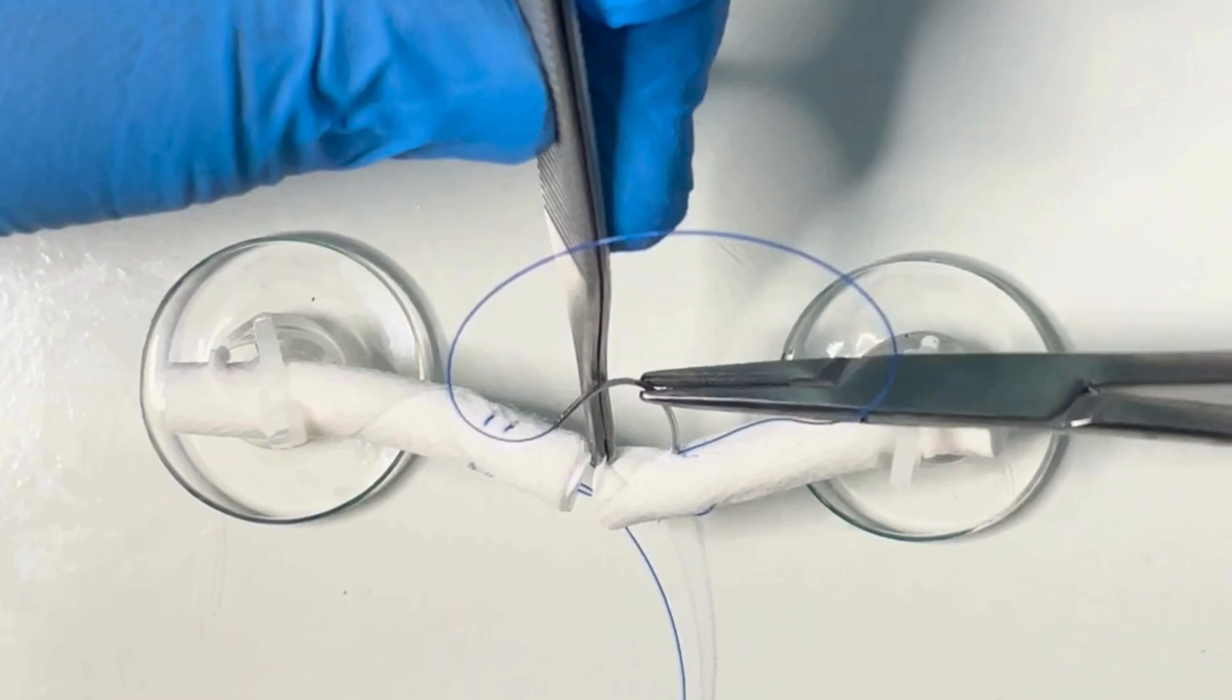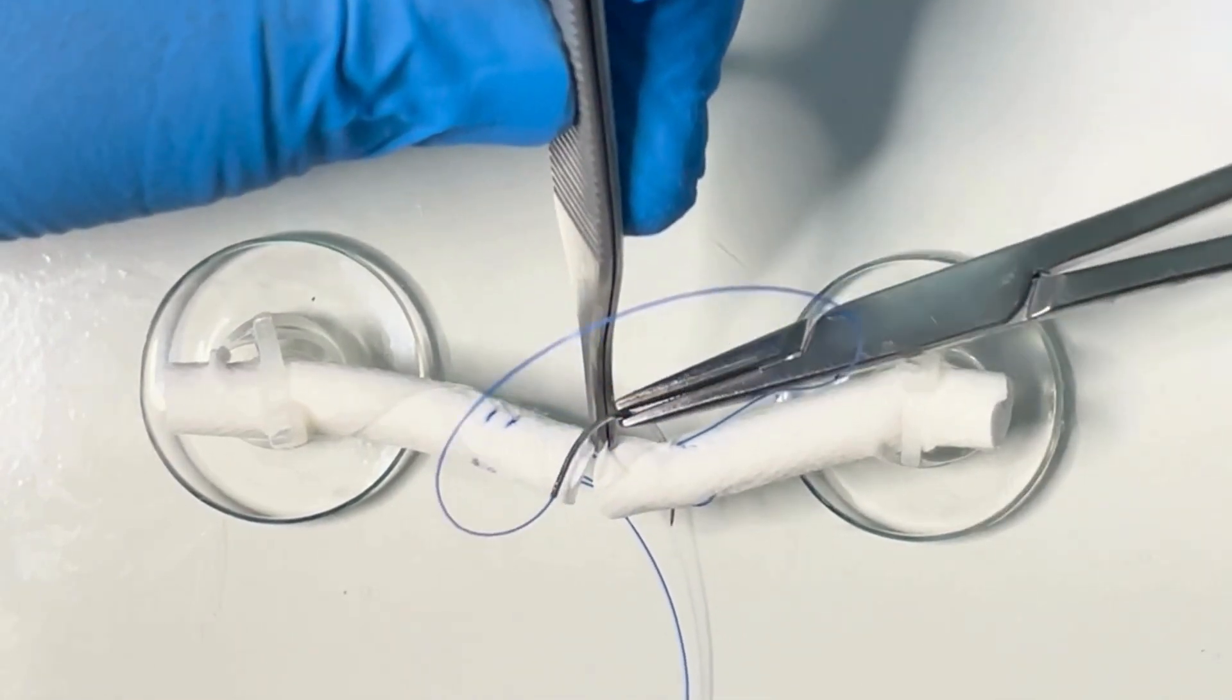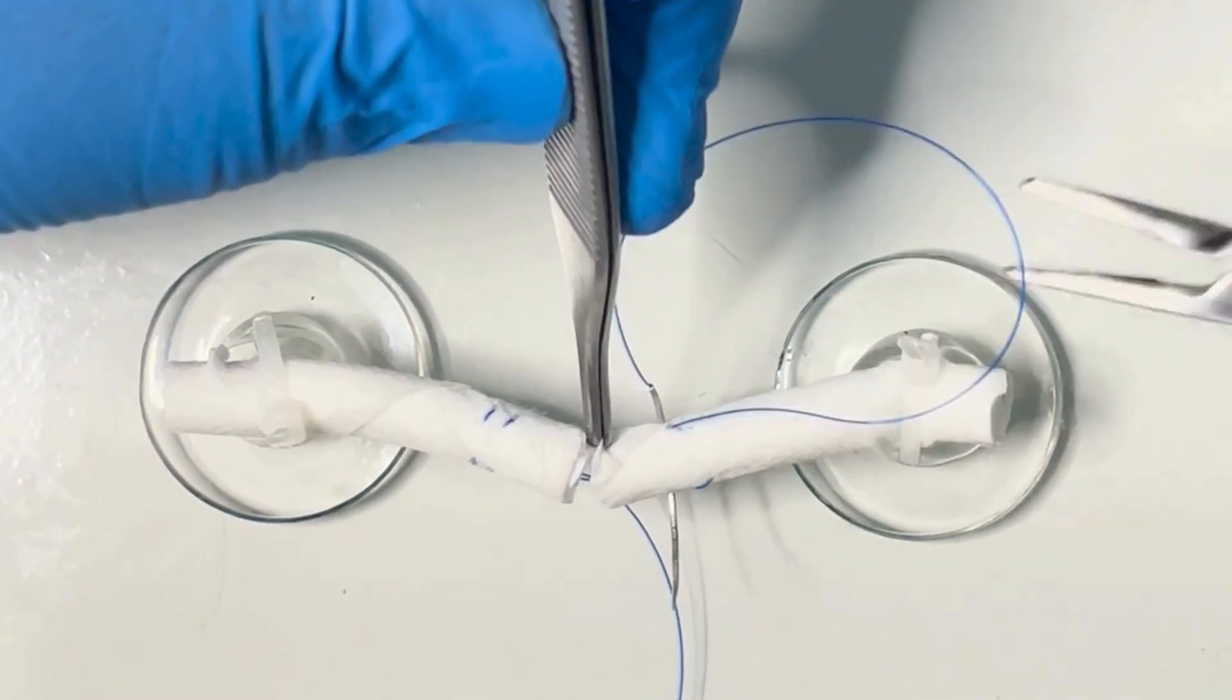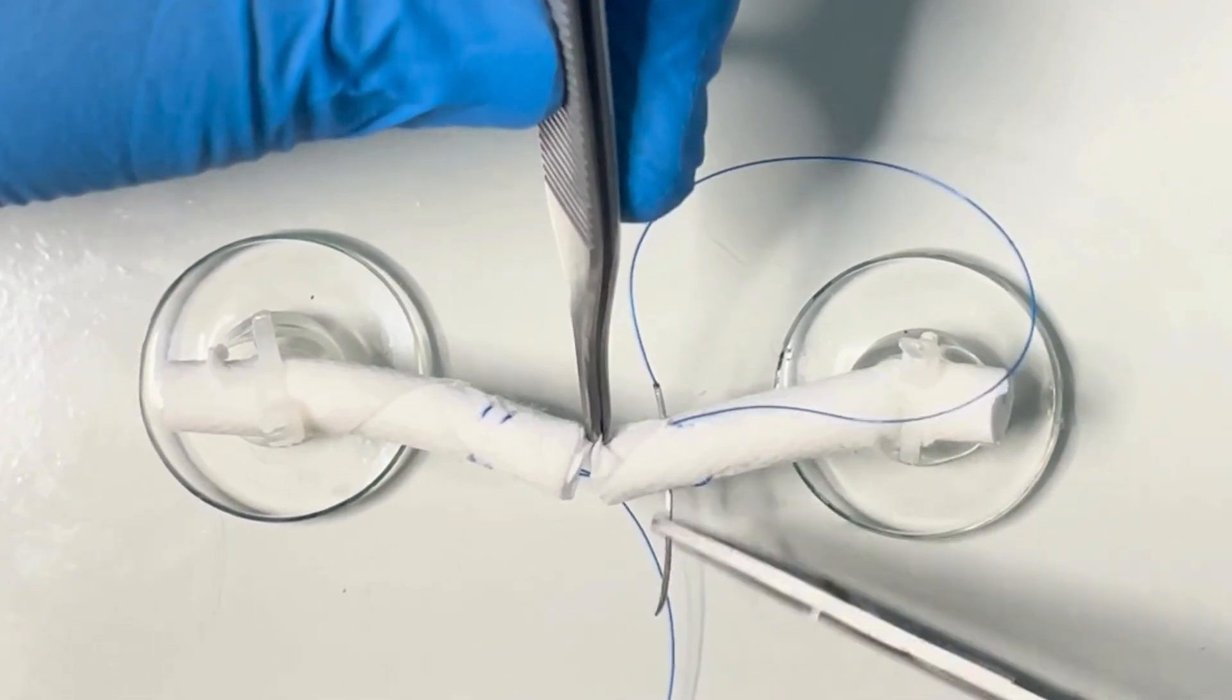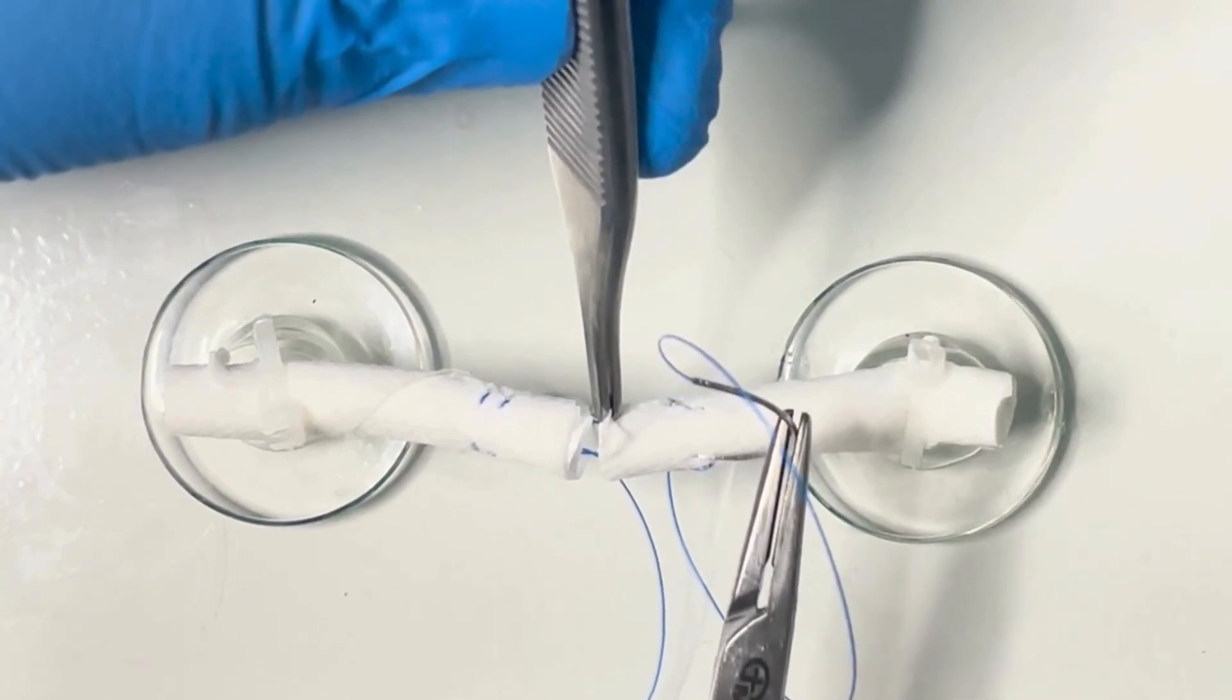You perform your epitendinous suture around this core repair to tidy up the repair site. The epitendinous suture adds 20% more strength.